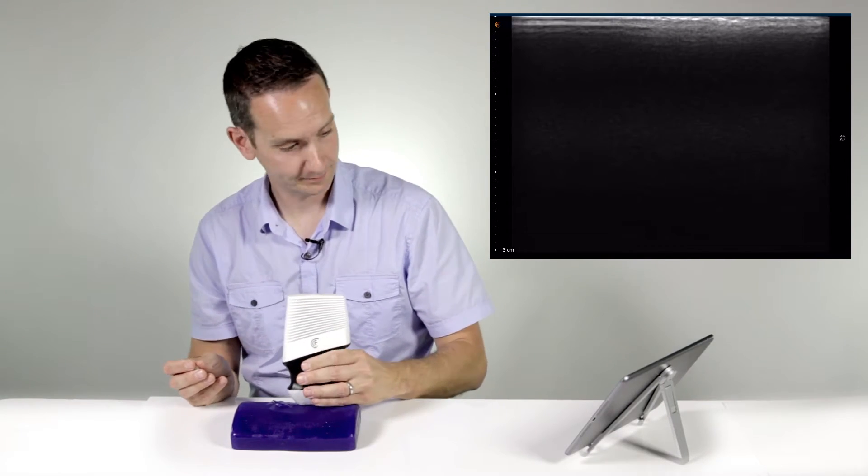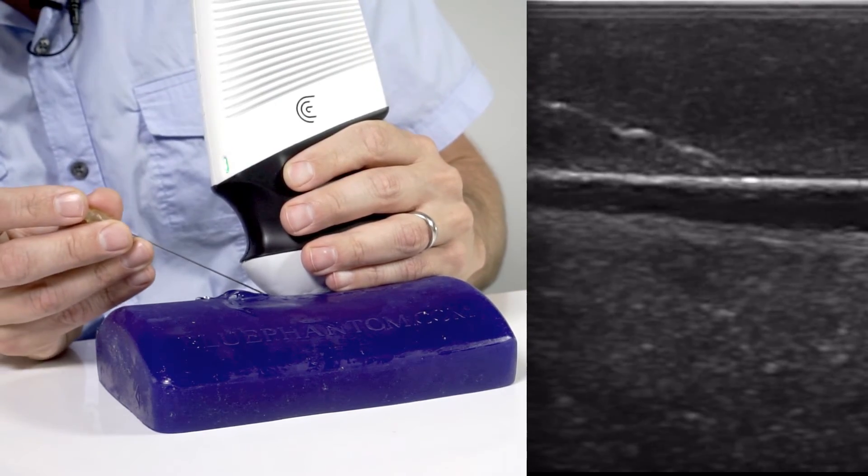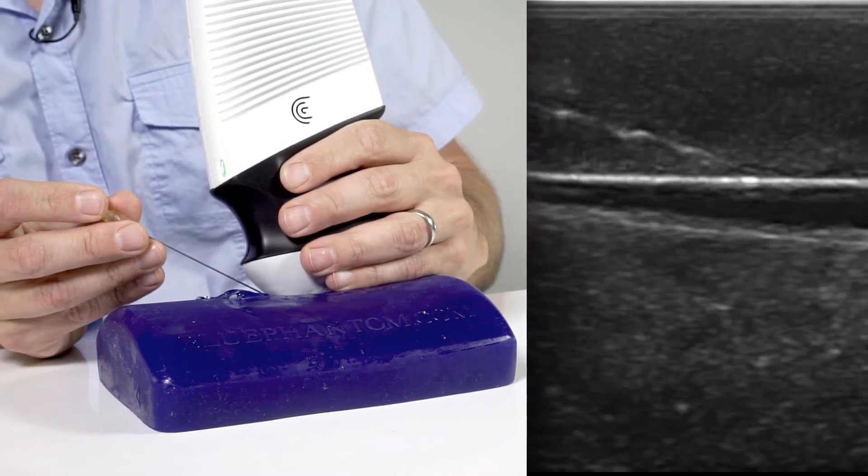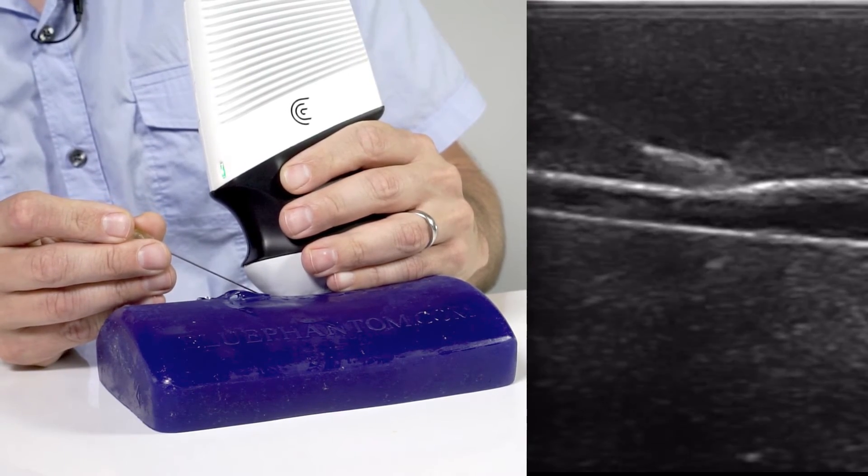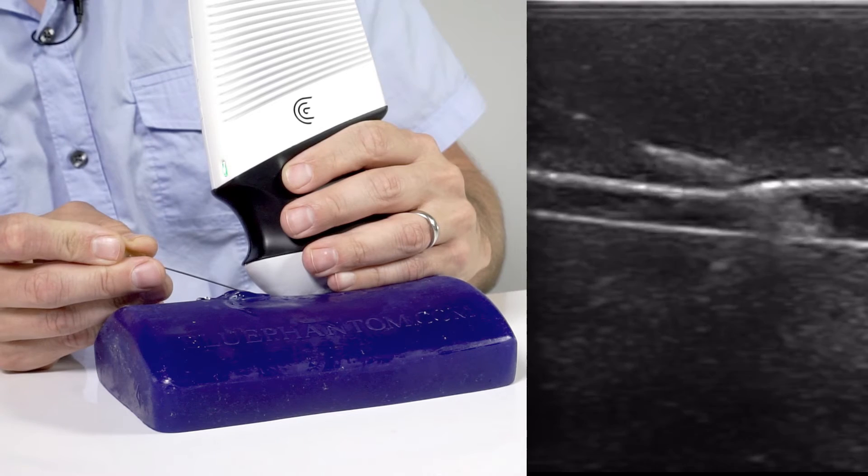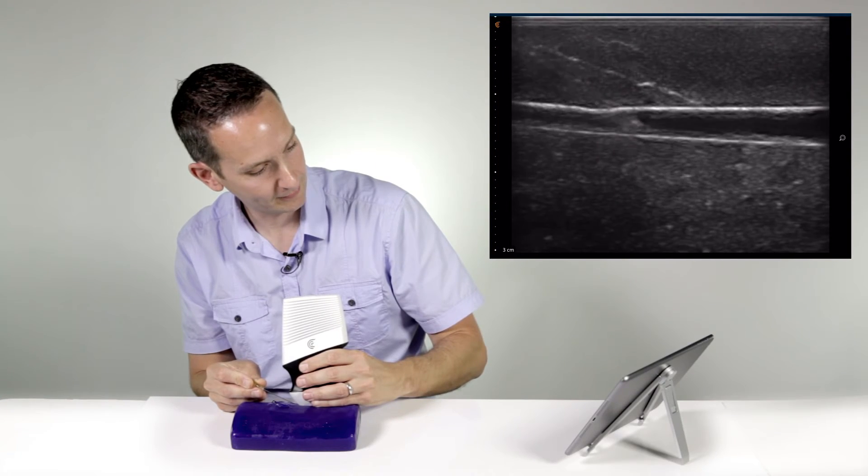For the long axis approach, line up the vessel on the screen, introduce the needle at about a 45 degree angle in the center of the probe and you should be able to identify the needle tip as it enters the vessel.